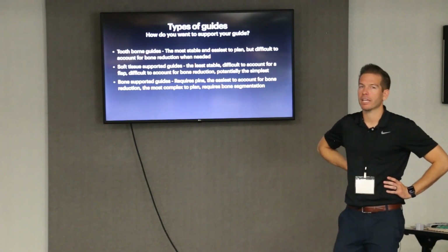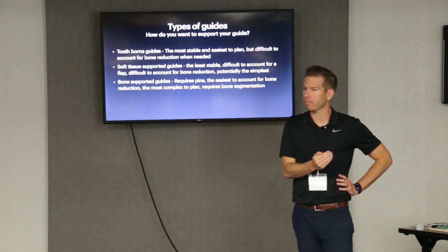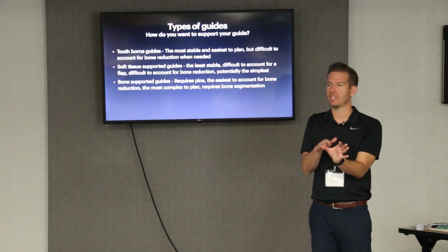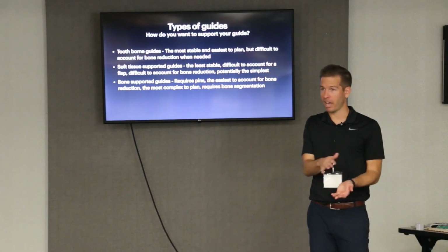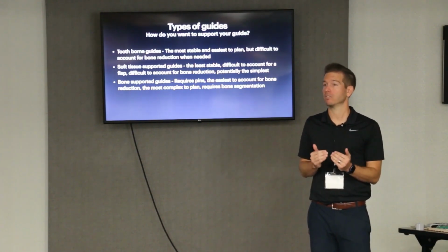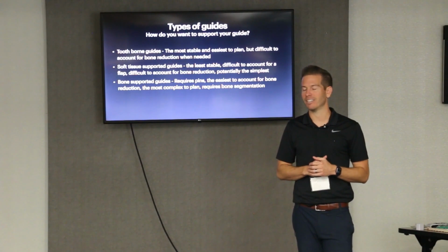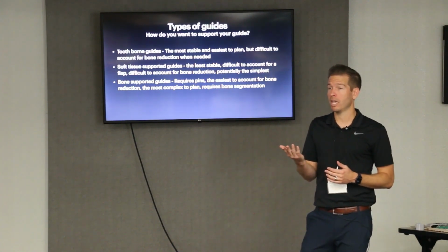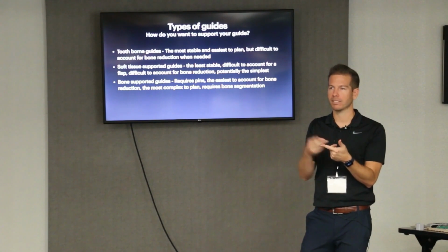Early on, I was a little leery about just eyeballing the reduction to my implants. So I made a bone reduction guide that shows me where I need to reduce the bone. And I found out this isn't really helpful. You can see your implant down there, and you just take the bone down until, okay, it's at the right subcrestal level. It's really not difficult. So I figured I don't need to make these bone reduction guides. It ended up being a waste of time. And just like we talked about before, simple. Now you can do these cases between patients: selectively extract some teeth, digitally place the implants, and go build a guide on that.